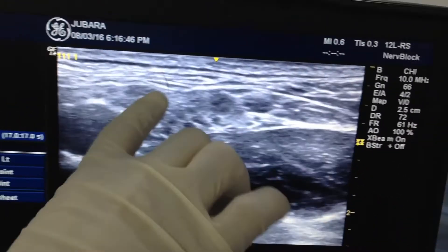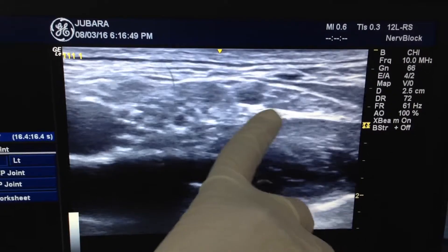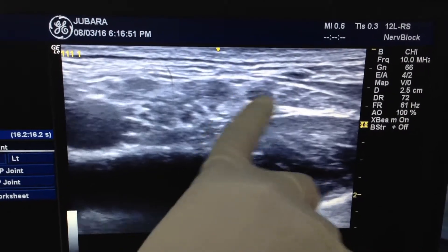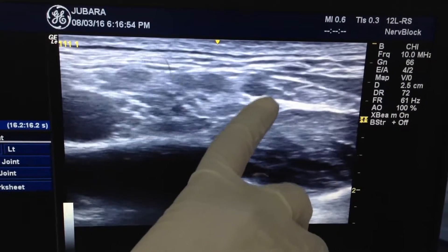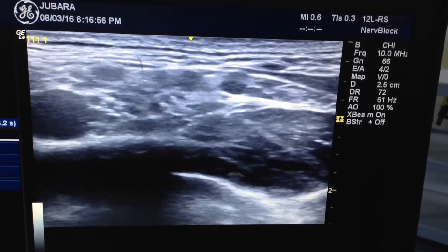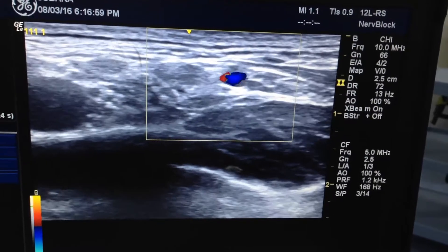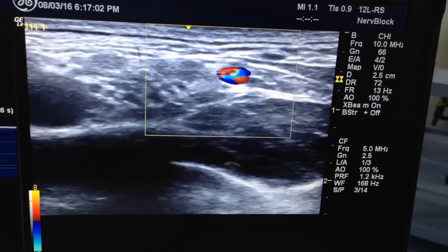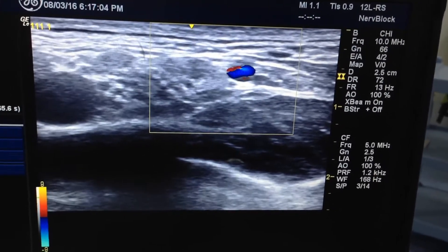Here you can see the trunks of the brachial plexus, but here you can see this is like a hypoechoic round structure, like a root or a trunk of the brachial plexus. But in reality, if I go to color Doppler, you can see this is pulsating — this is maybe the dorsal scapular artery or subclavian artery.